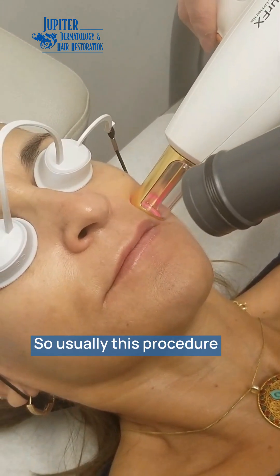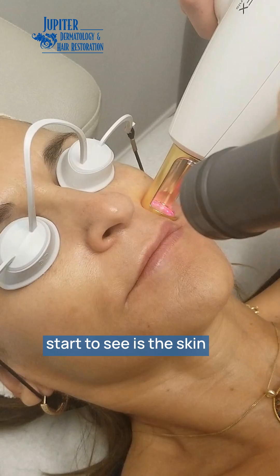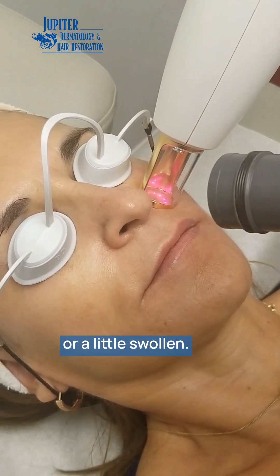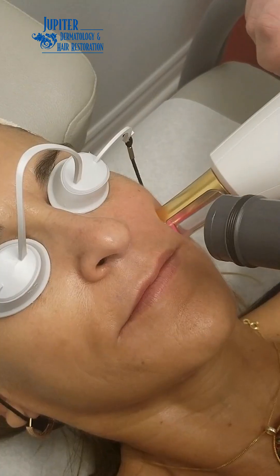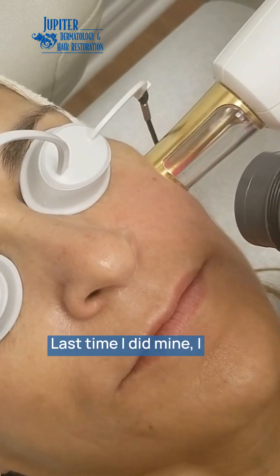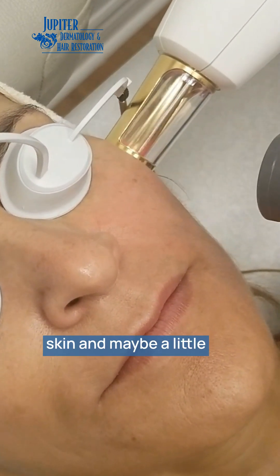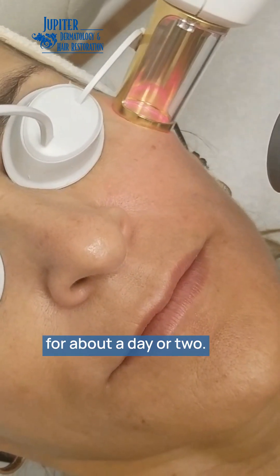This procedure typically takes about 15 minutes. What you'll start to see is the skin kind of pinks up and gets a little puffy or swollen, and that typically lasts for about 24 to 48 hours. It's pretty much considered a no-downtime procedure — last time I did mine I worked the next day and no one knew I had anything done. You'll just have a little pink to your skin and maybe a little puffiness that most people actually like, for about a day or two.